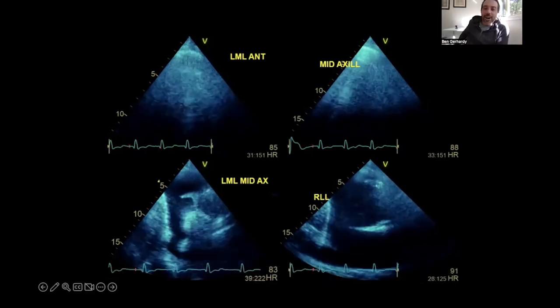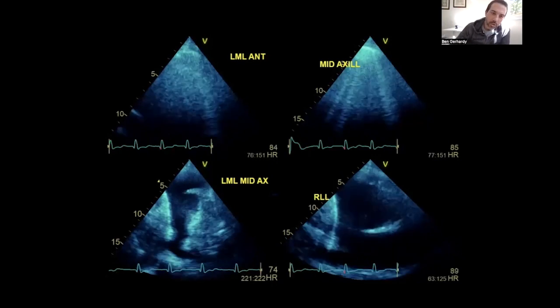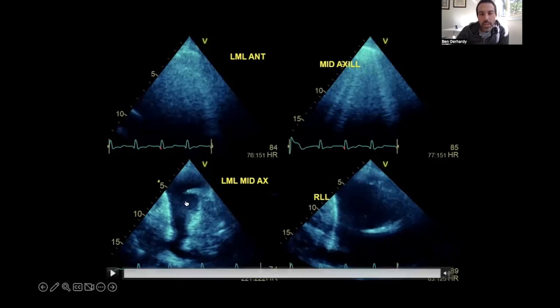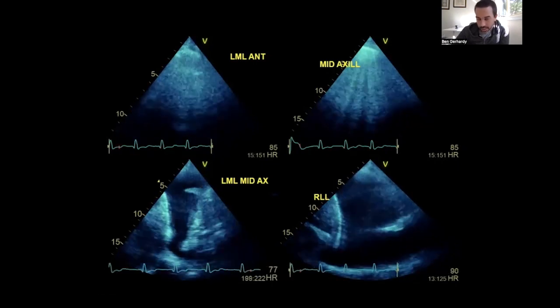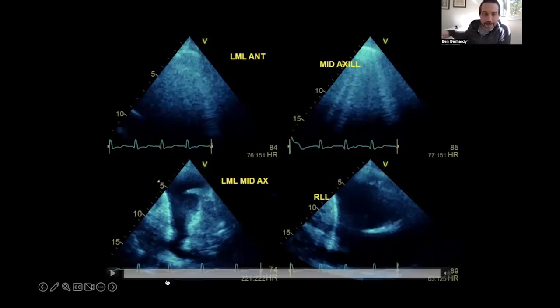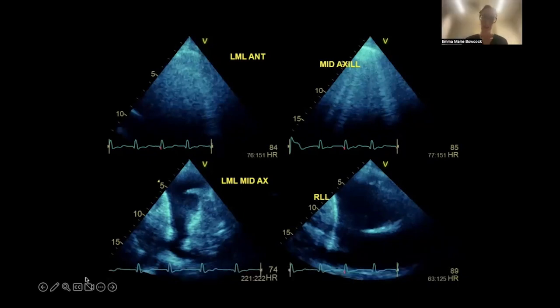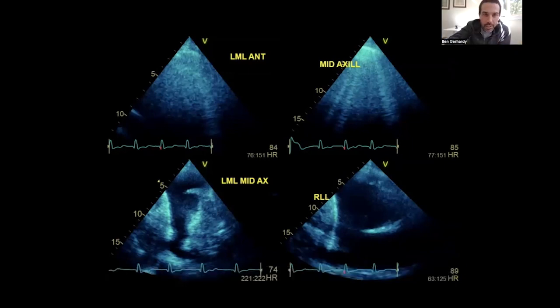Yeah, I think I would say that there's pathological B lines in both. In the left middle lobe, there should theoretically be a few less than the left lower lobe, just from gravity and dependency. But I'd say there's a bilateral interstitial pattern and bilateral simple anechoic pleural effusions. I think that they probably are closer to just being all merged. Confluent on this one, yeah. Because you can't see any A lines in either of them, especially on that left side. So maybe it's actually one giant B because they're all together.